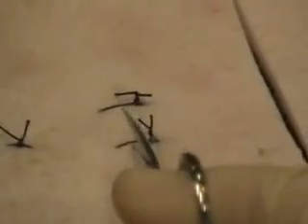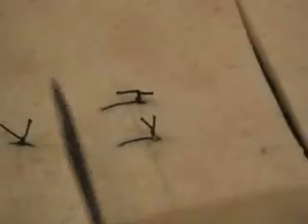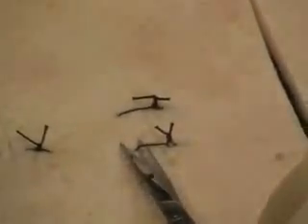Notice, let's say we were going to take this simple interrupted suture out. You wouldn't want to just clip halfway between and then drag all this dirty tail all the way back through our wound. You would want to try to clip as close to the skin as possible here. And sometimes a number 11 blade is easier than getting scissors under here. You can just slide a number 11 blade underneath here and clip that. Now you can see the top part is free, and when you pull on the knot, you're really not dragging a lot of the suture that's been there for a week or so through the wound.